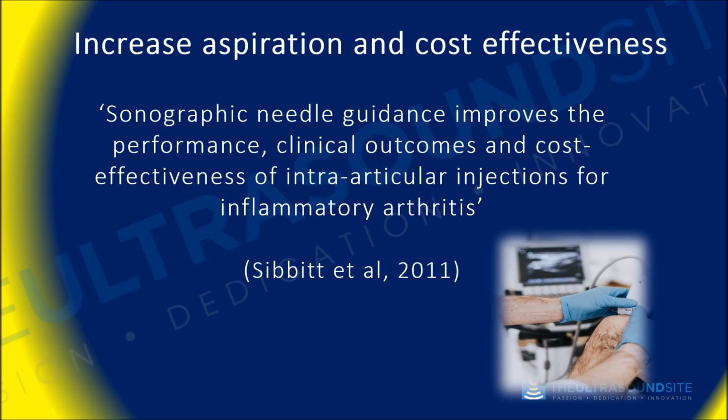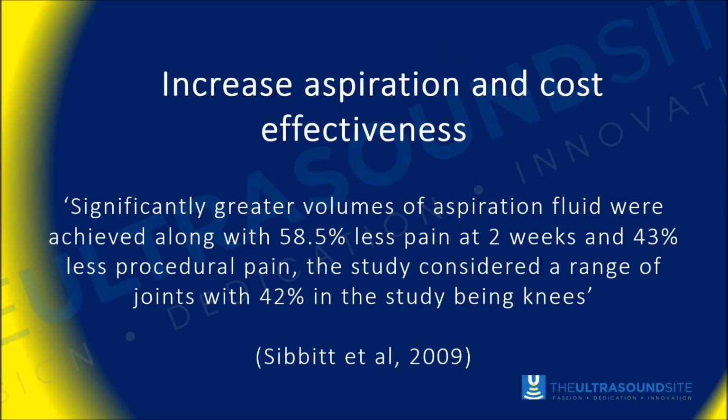Obviously these other techniques that we're going to talk about in a moment also lead in from this idea that with increased accuracy you're able to perform more intricate and more complex tasks with the injection, and also more advanced procedures like barbotage and hydrodistensions, for example.